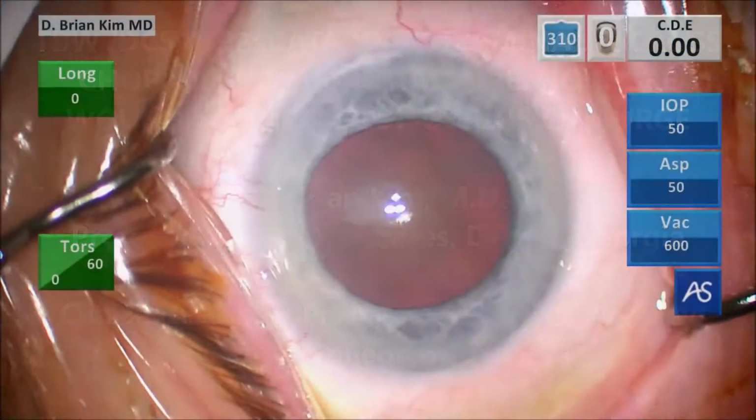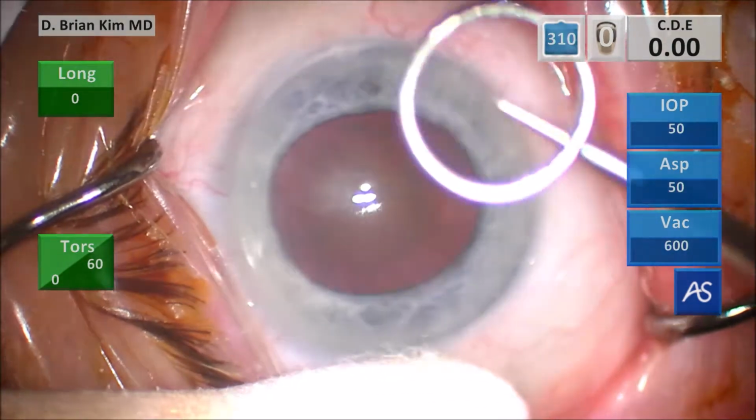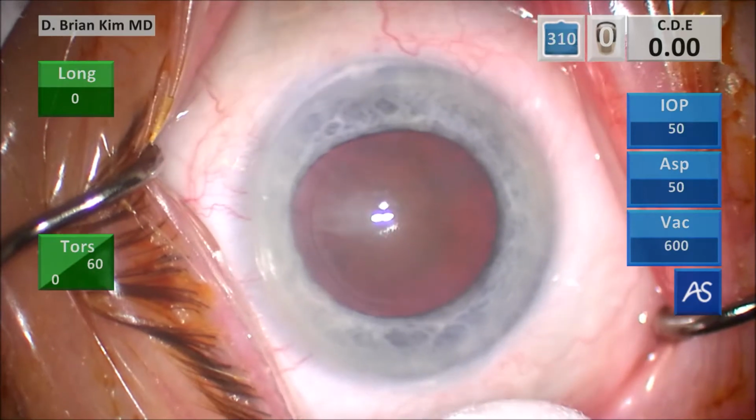You can see this is a rather dense cataract. Look how cloudy the view is. I'm using the cotton tip to steady the eye. I use a corneal marker, which will help me to center and size a rhexis.